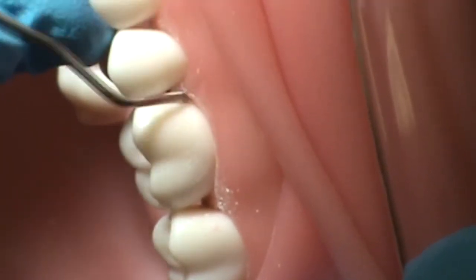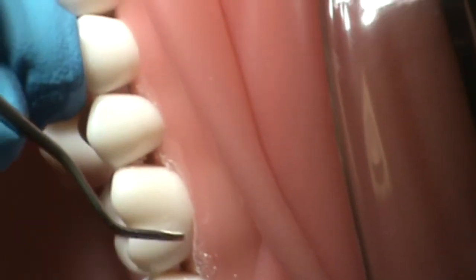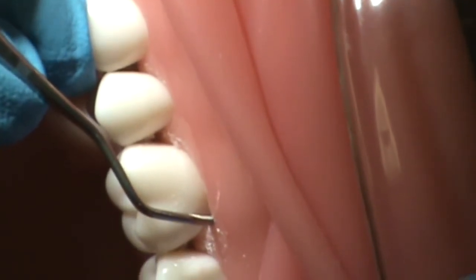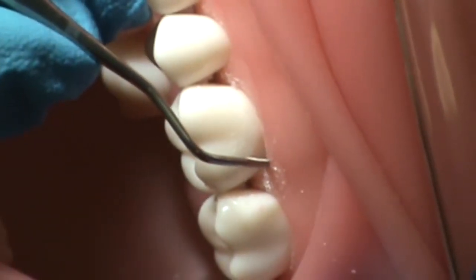To scale the distal of the tooth, she will remove the instrument from under the gums, roll the instrument so that the tip is aimed towards the back of the mouth, as this is the direction she will be scaling. She will reposition back at the distal facial line angle and establish correct angulation.